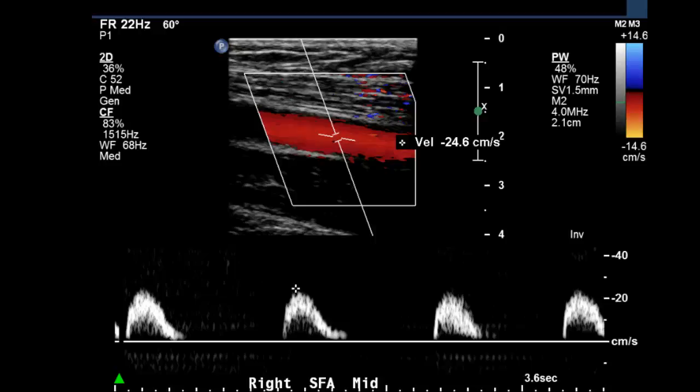So what are the keys to interpreting this study? Let's look at the inflow artery waveform and velocity first, and you will see the abnormal waveform in the mid SFA, which immediately gives you an indication that downstream there is likely an obstruction.